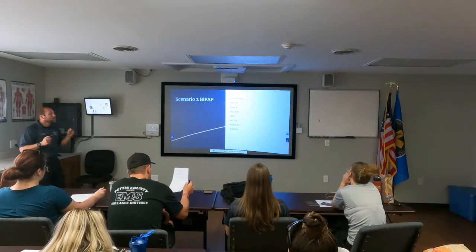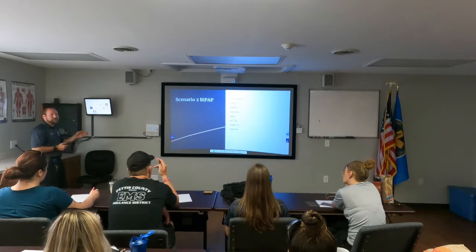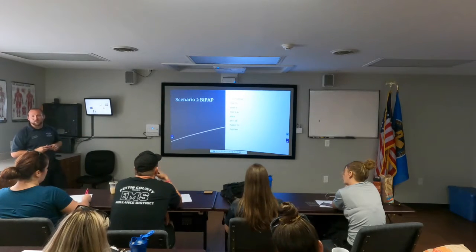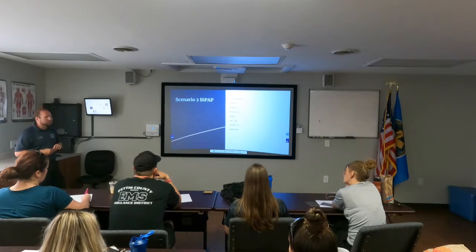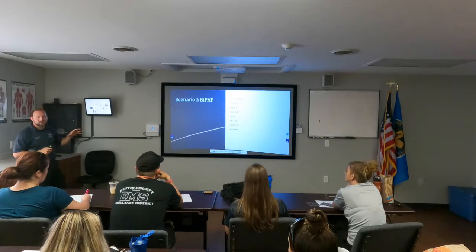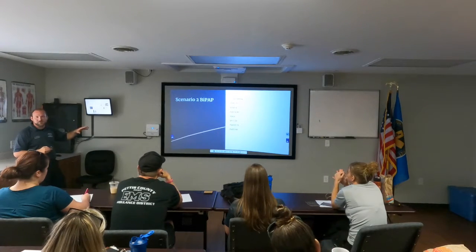So, first thing we need to figure out is what is our current pressure support with this patient with these current vent settings, BiPAP settings. Pressure support, what is it? Yeah, because we're taking our IPAP, subtracting our EPAP, and that gives our pressure support, and that's 6.